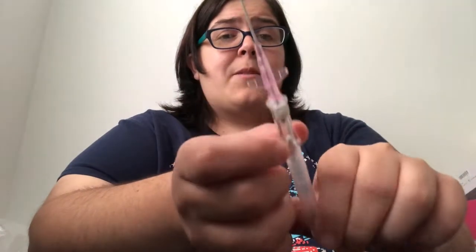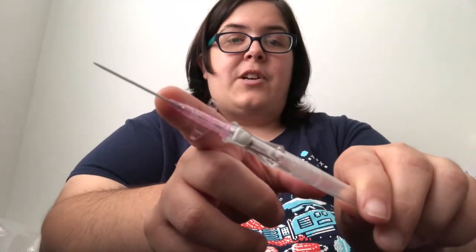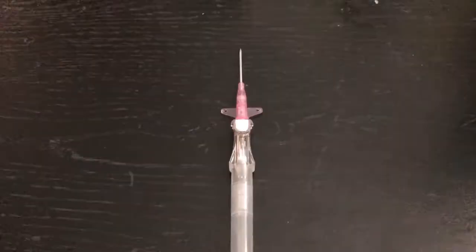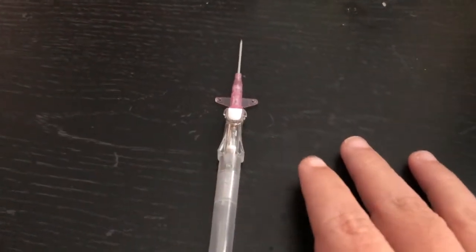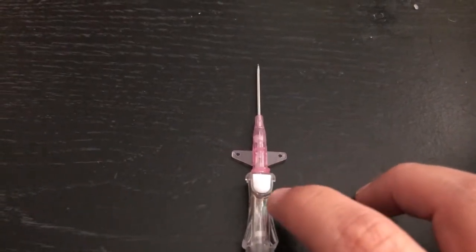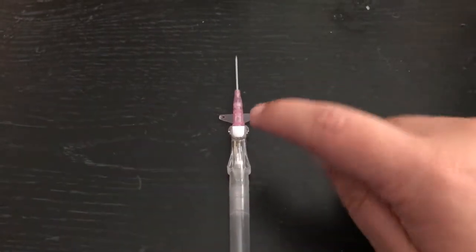Yeah, so let me flip this around. Like I said, this is a large needle. This is for inserting IVs or starting IVs. And I'll show you what this looks like afterwards. So let me flip it around. Okay, now just imagine that this is in your patient's arm or hand or wherever. Now we're going to push this little safety button here and watch what happens.